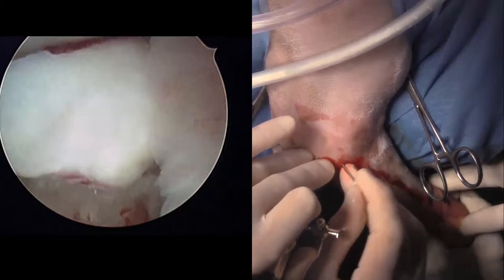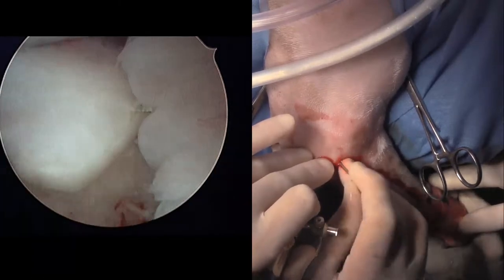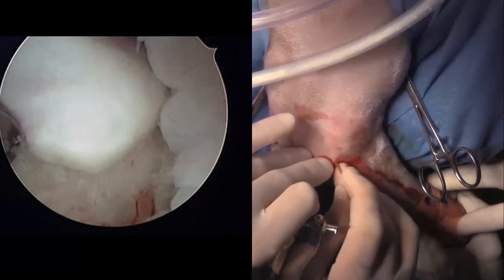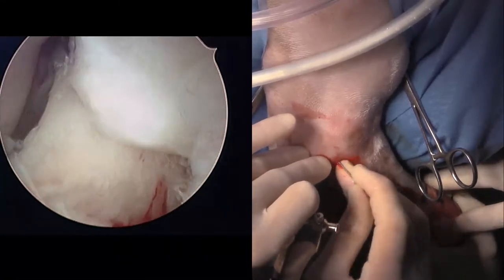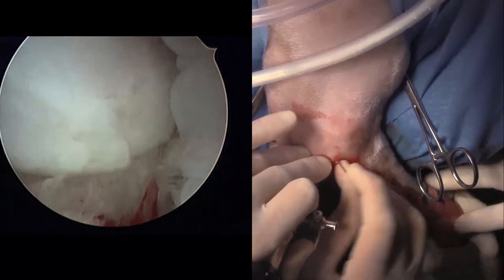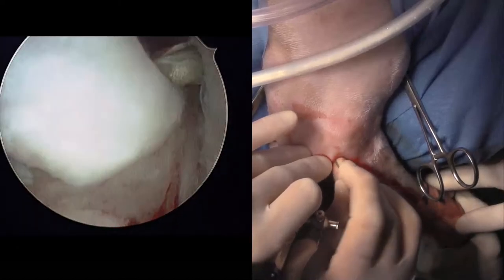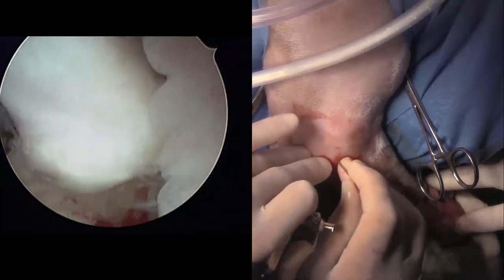That's just a great fragment sitting there, just popped out in the middle of space. So I'm just using the needle to try to push against it, to try to elevate it and release the soft tissue attachments. It's uncommon for you to get in there and see a fragment that's just so freely floating in space. There we go. So I've released that.